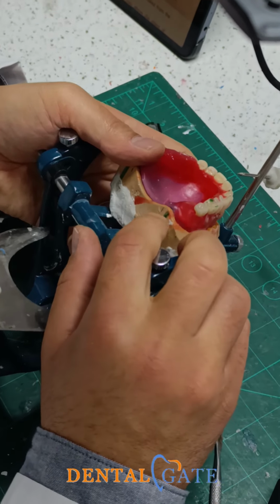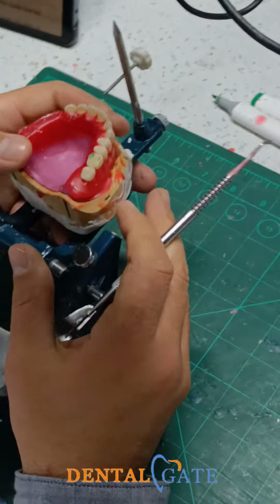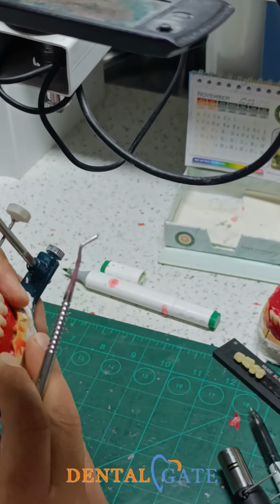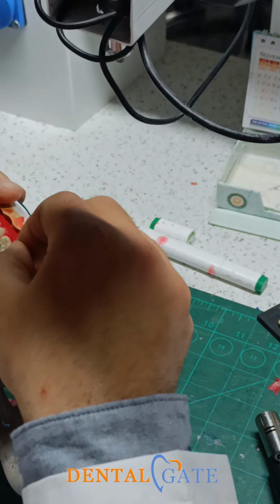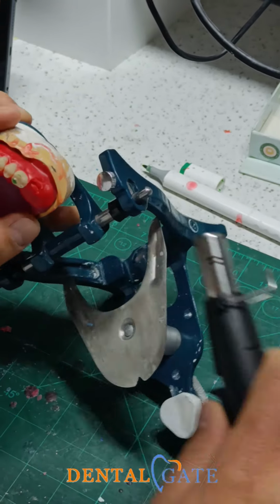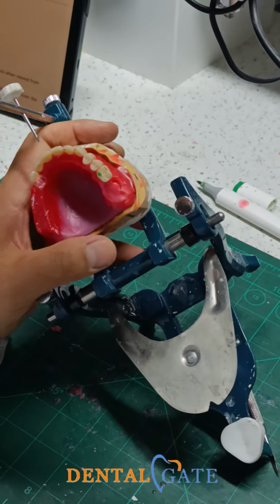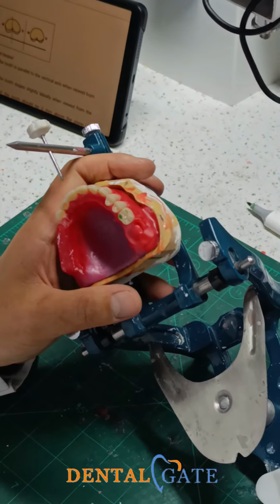You can see the crest of the ridge now. The teeth seem out of the crest of the ridge. You can make another tilting, because within the demonstration, I cannot focus upon all the criteria. It's easy to make evaluation, and sometimes I will make a mistake. I cannot accomplish all criteria. You can make a mistake.